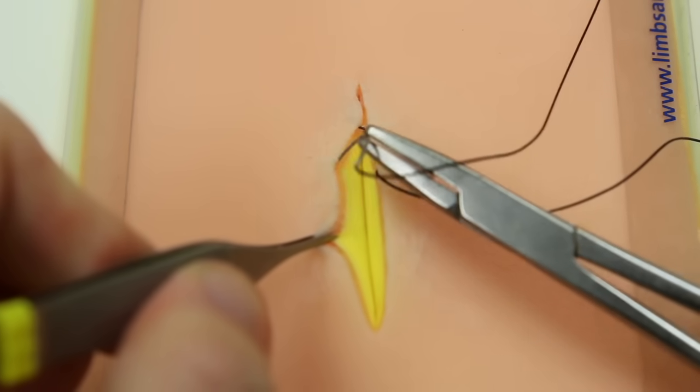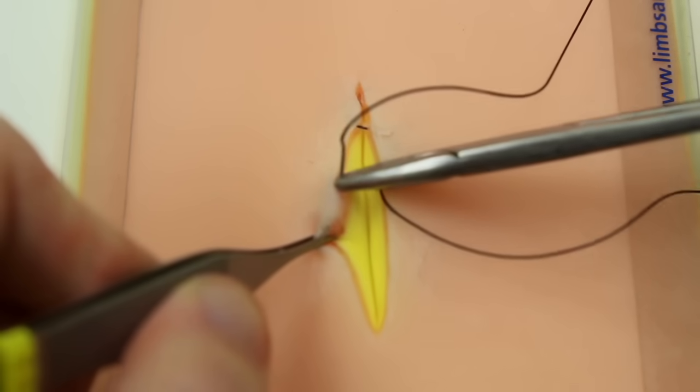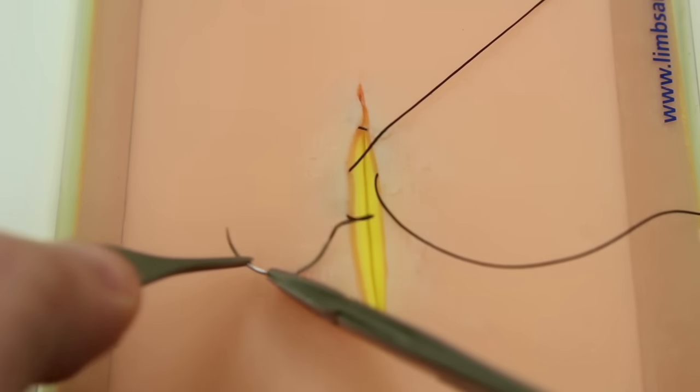As you can imagine, if you pull things together that aren't at the same level, then one skin edge gets proud relative to the other. And that can make for an ugly incision.